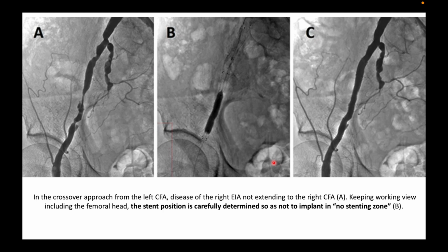Or there are special stents from Boston, from Abbott Vascular, which can be used. They are interwoven stents, have special radial force, and they can be used in areas where you have bends like the groin and the below and the knee level. So they are sort of kink resistant, and they can be used for this purpose.